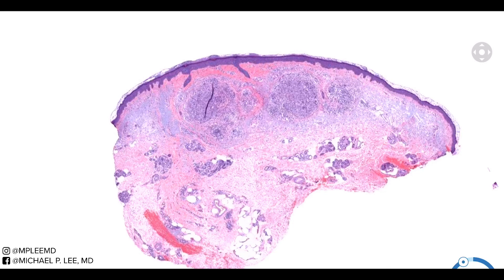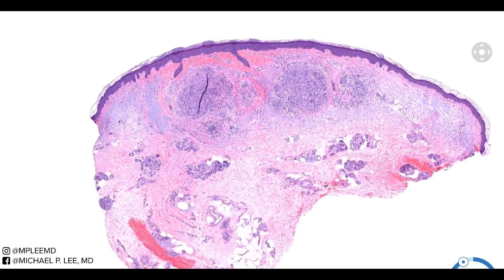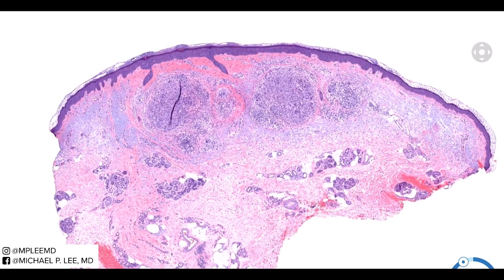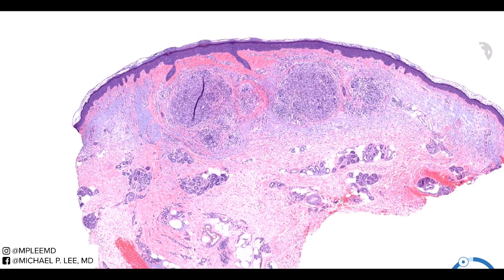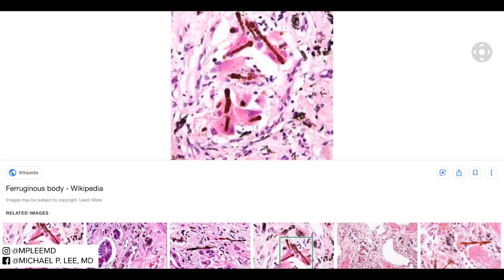There are a number of different answers for this case, ranging from chromomycosis and phaohyphomycosis, and actually one other very interesting differential being ferruginous body — which is this structure right here. These are actually present within asbestosis — asbestos bodies.